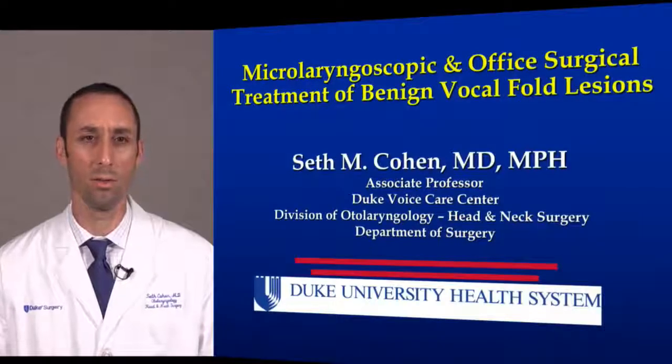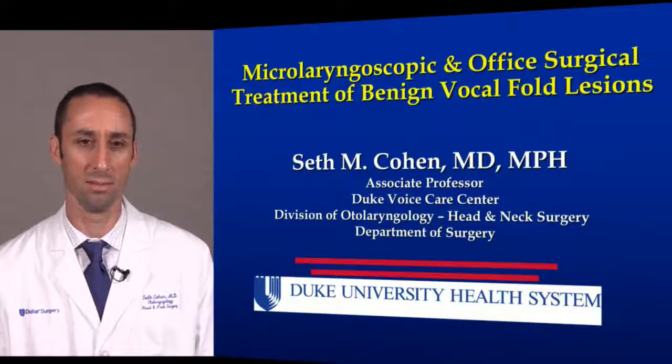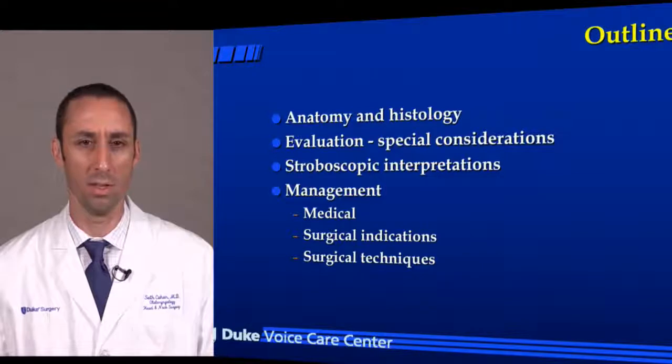So we're going to talk about microlaryngoscopic and office surgical treatment of benign vocal fold lesions today. What we'll do is review the anatomy and histology. We'll talk about the evaluation and some special considerations. We'll go through some of the important aspects of the stroboscopic interpretation.